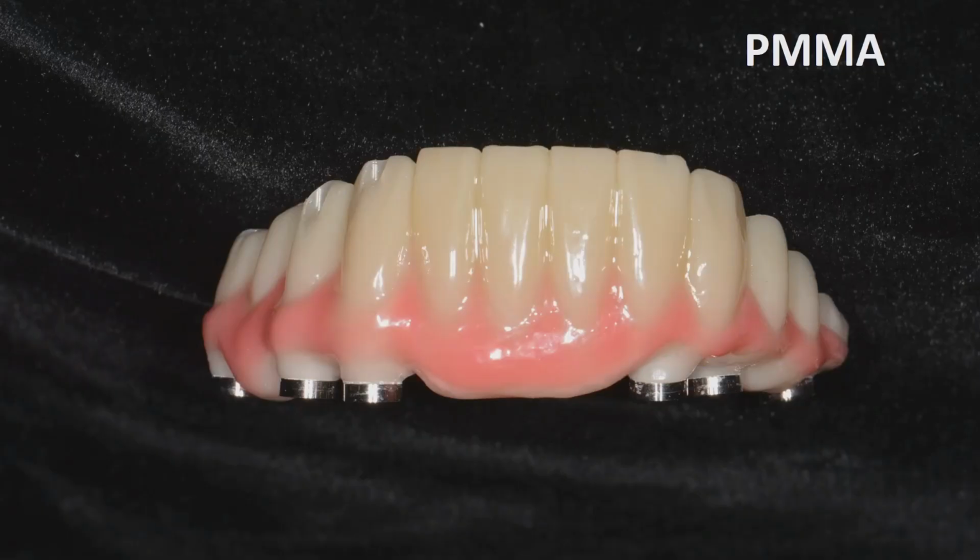Therefore, we fabricated the second provisional prosthesis having long teeth by milling PMMA blocks. One week after the operation, we removed the sutures and placed the second provisional prosthesis in the patient's mouth.